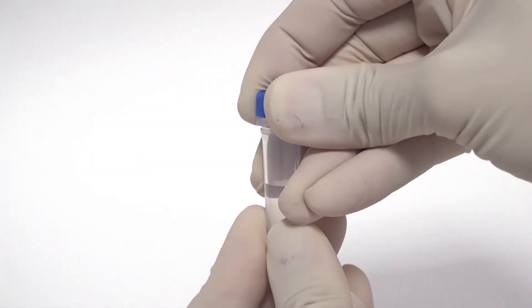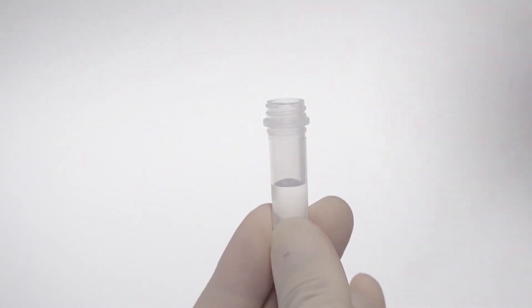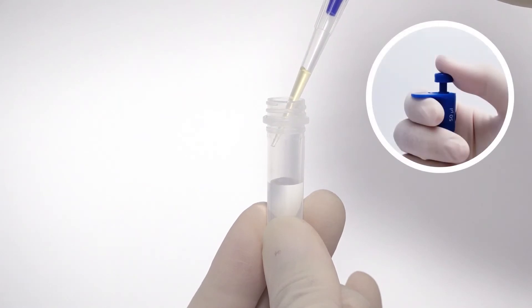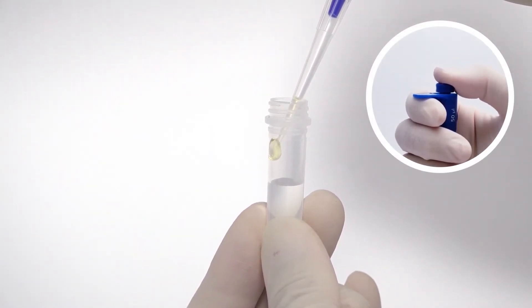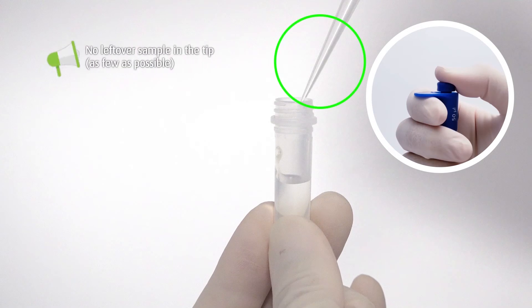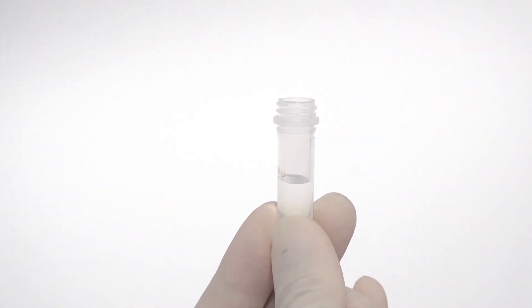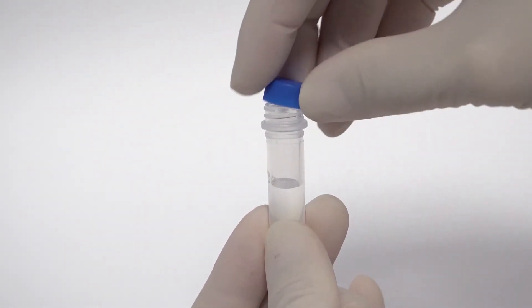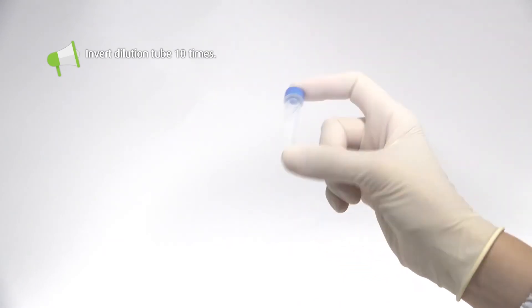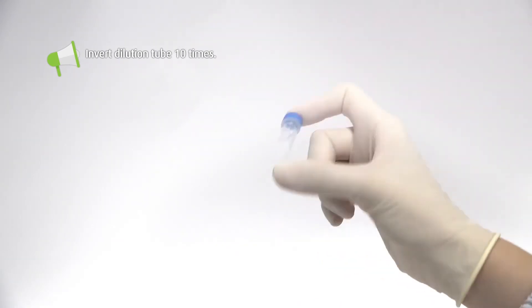Then open the cap of the dilution tube. Gently and slowly inject the sample into the dilution tube along the upper side wall, and make sure the sample has been pushed off the tip. Close the cap tightly after injecting the sample, and invert the dilution tube 10 times to thoroughly mix the sample.